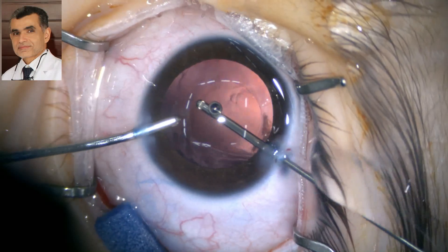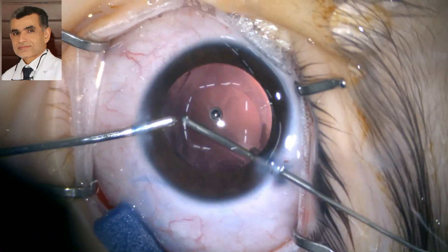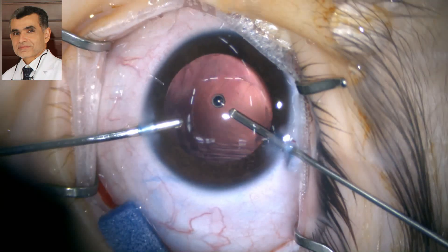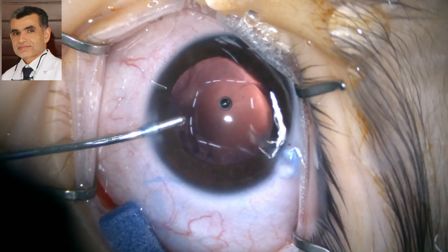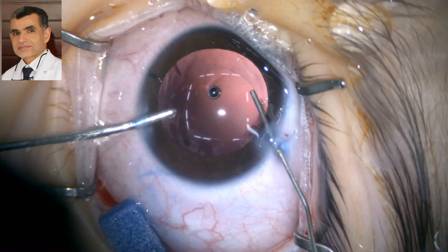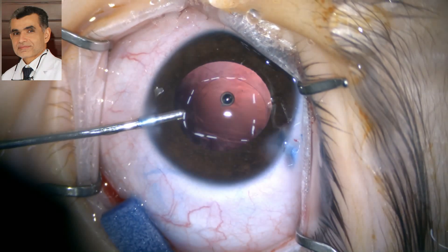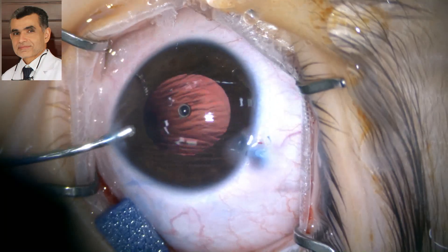You can change the setting on the Centurion from anterior vitrectomy to IA-cut sequence. In this second step, you can use the same probe as irrigation-aspiration — instead of switching to separate IA probes — to aspirate all the viscoelastic from inside the eye, and also use the low vacuum setting to polish any remaining material.